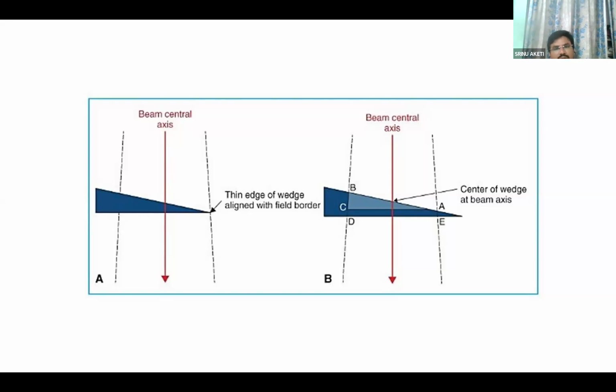Okay, 30 will be there. For any field size of 30-degree, you can use this one, 30-degree. Now we understood?